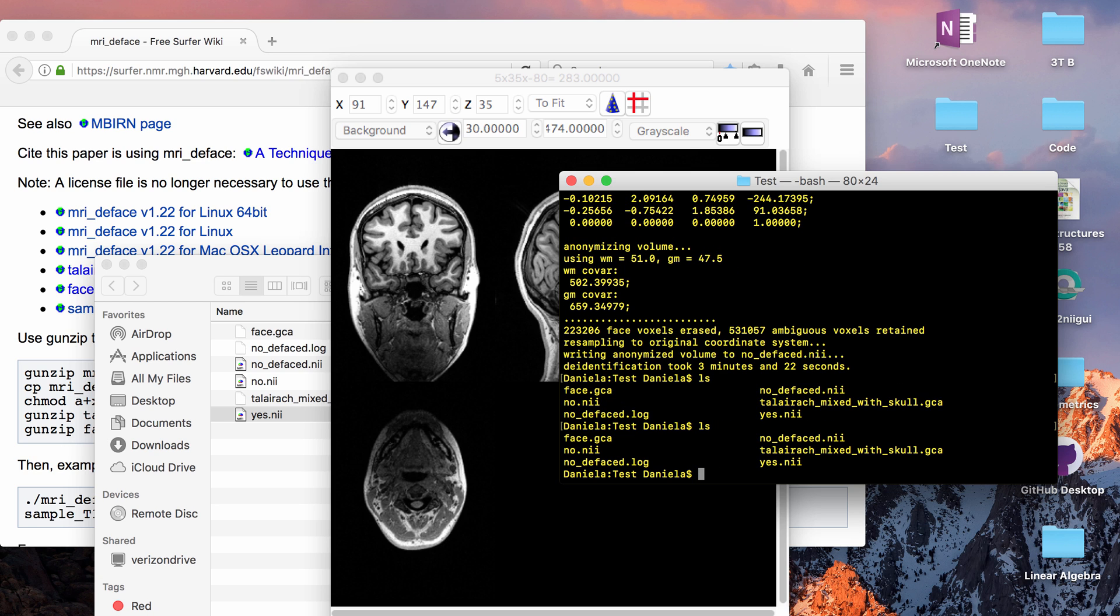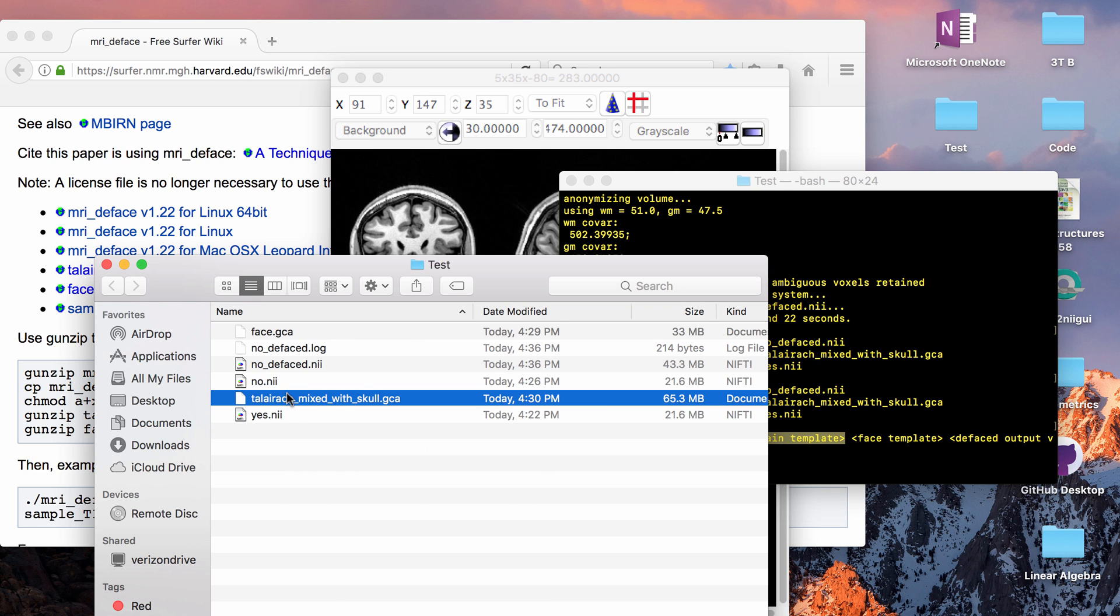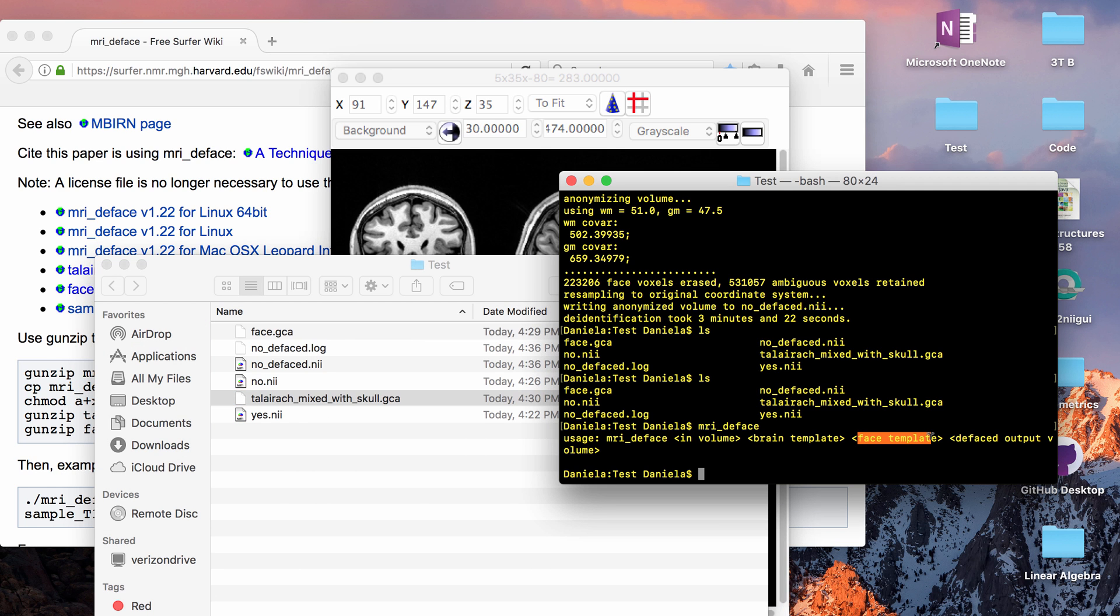So the way you would run the deface function is it asks for an input volume which is the nifty or the mgz whatever file that you have, the brain template which is the talairach mixed with skull, the face template which is the face file, and then whatever you want to name the output volume. So usually you just add underscore defaced so let's go ahead and run mine.